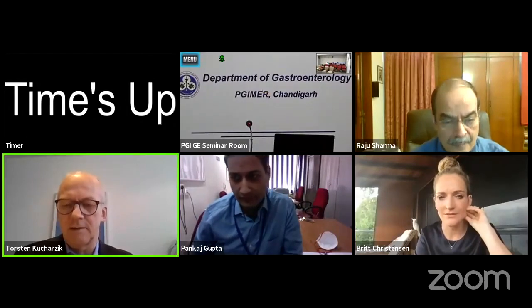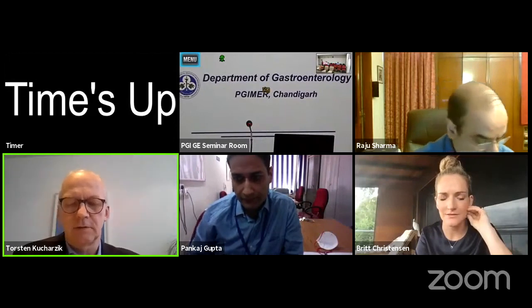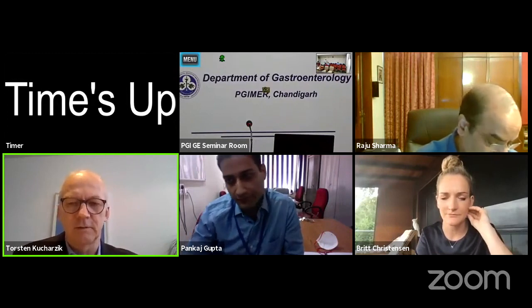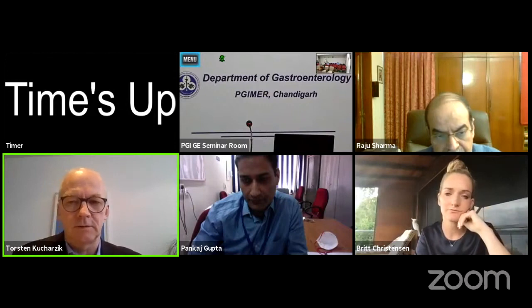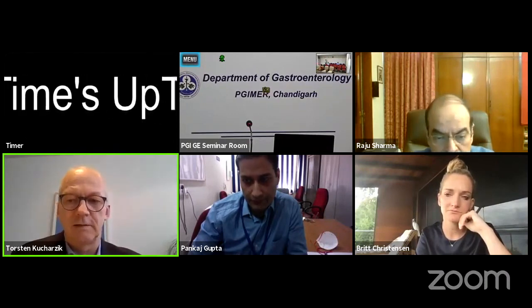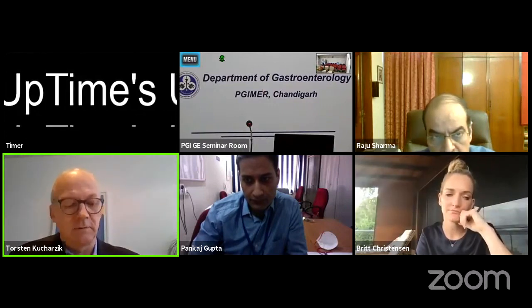I can start. I think it's a good point. In most situations, oral contrast is not required. If you look at small bowel pathology, in particular small bowel strictures, and you don't find them, it is sometimes helpful to use oral contrast. You can give the patient 250 mils of PEG solution to drink, and then follow up the small bowel, which might increase sensitivity. There are papers, Emma Calabrese published a lot about this, but I think it's not required in all patients.